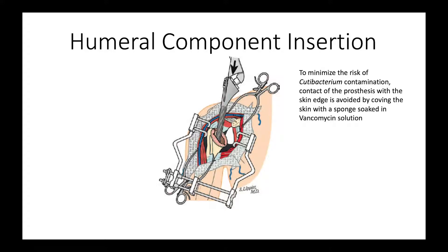When it comes time to insert the humeral component, one of the things we want to be mindful of is the risk of contamination from Cutibacterium that lives in the skin of patients, particularly young males. We wrap the skin edge at the moment of insertion with a vancomycin-soaked sponge and are very careful to make sure that the prosthesis doesn't touch that skin edge.